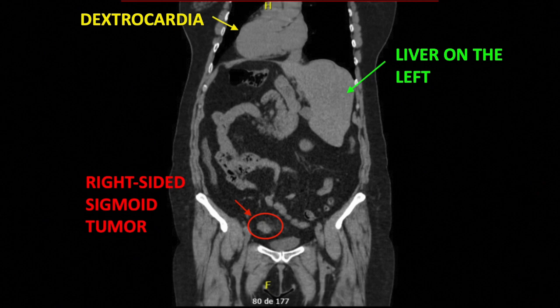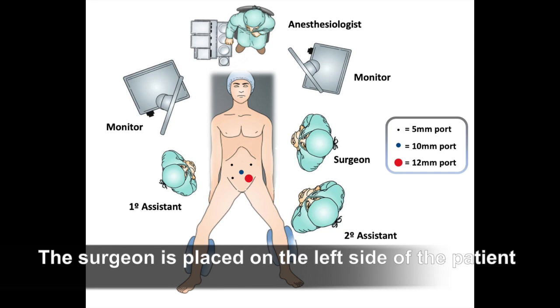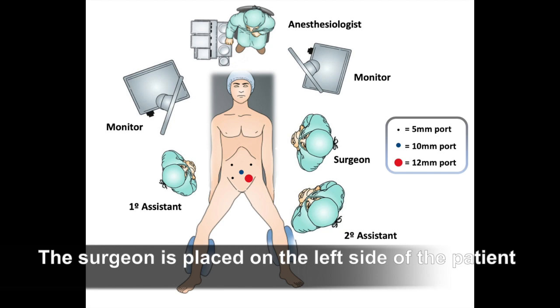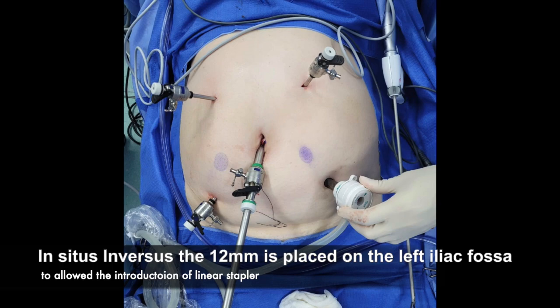The patient is positioned in the Lloyd-Davies position. As shown in this schematic image, the surgeon operates on the opposite side of usual, positioning themselves to the left of the patient with the monitor on the right side. The trocars are mirrored, with a 12mm trocar in the left iliac fossa to allow for passage of the linear stapler.